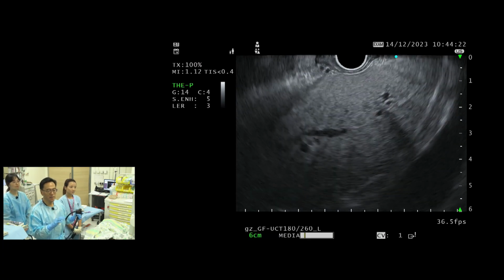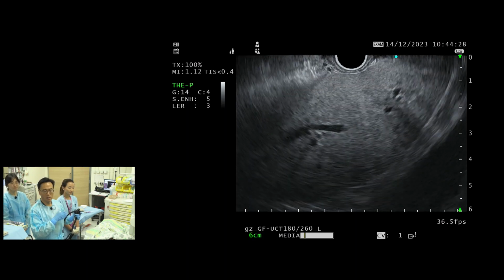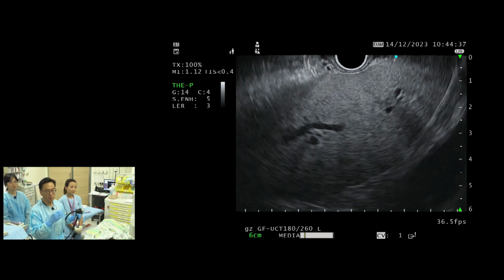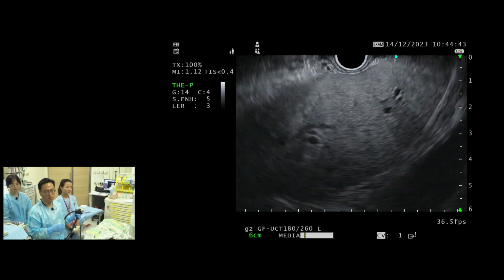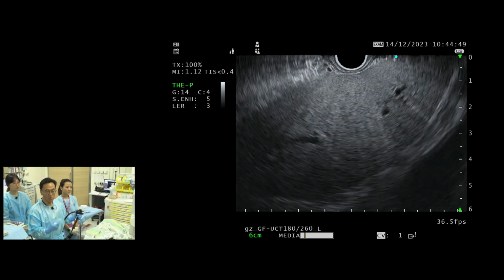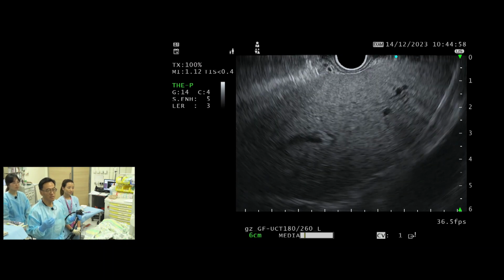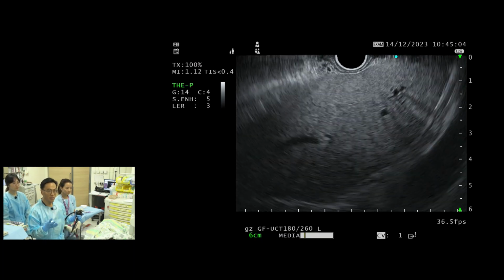put her on a non-selective beta blocker, and then repeat. One of the nice things about this technique is you can do serial measurements, once a year or whatever, to make sure that your beta blocker dosage is actually significantly lowering the portal pressure below the danger level, below 12 or 10. If we can lower her portal pressure down to 7 or 6, then that's the right dose, because our conventional way of titrating the non-selective beta blocker is systolic blood pressure, pulse, or orthostatic symptoms, which is only a surrogate, indirect reflection of the true portal pressure. So that would be of value.